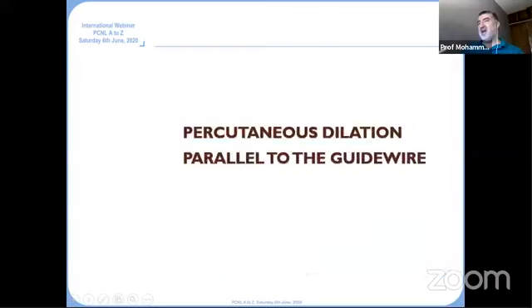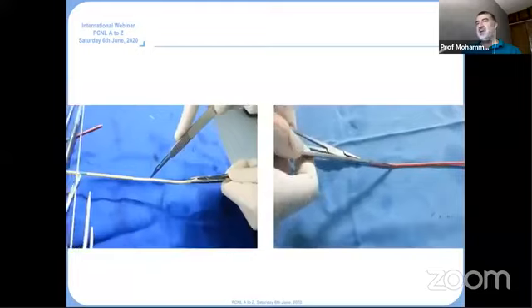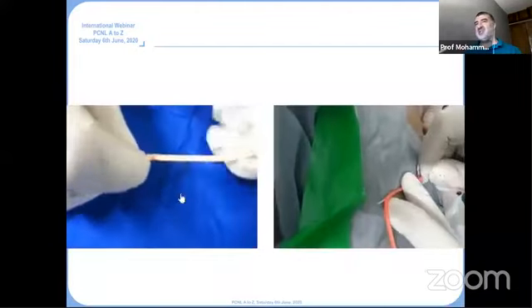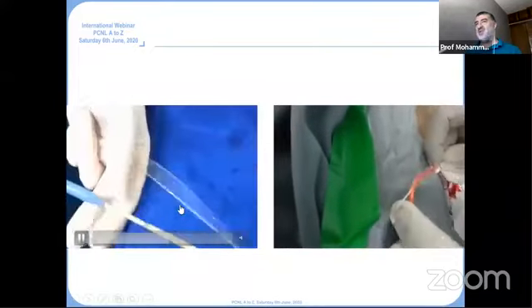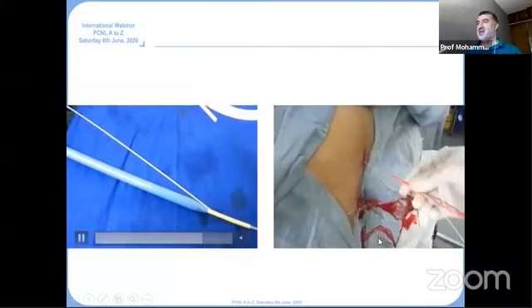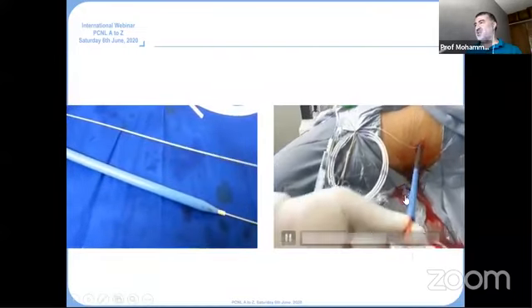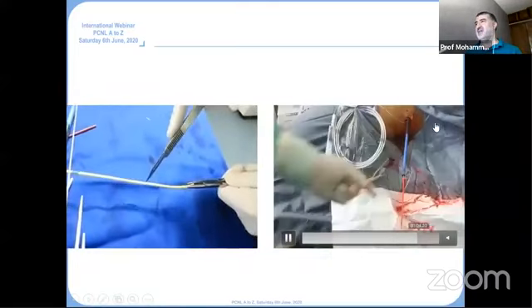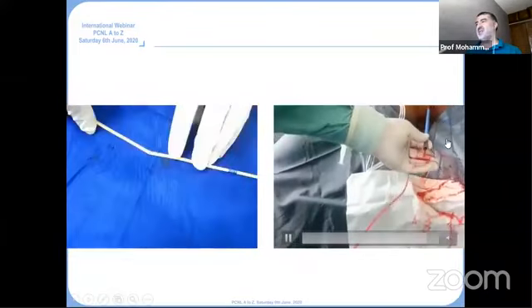Otherwise, now we are using more and more this technique. It is similar to the parallel access sheath, ureteral access sheath. So a slit is performed in an extremity of the ureteral catheter or guide wire pusher. And by pushing the dilator over the catheter, it dislodges the guide wire. So here in a patient, the guide wire is stored outside, and we do the dilation over only the catheter. Of course, it has to be a stiff catheter. And at the end of the procedure, we had used only one guide wire, and the guide wire is outside the Amplatz sheath.